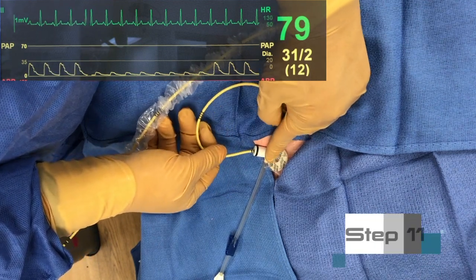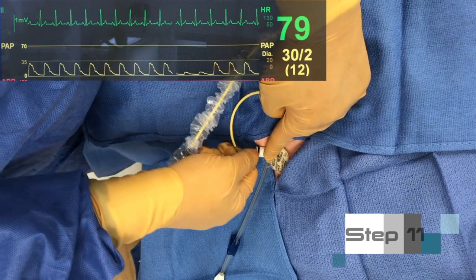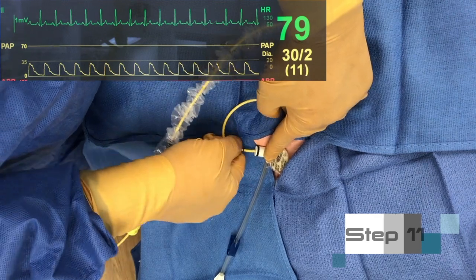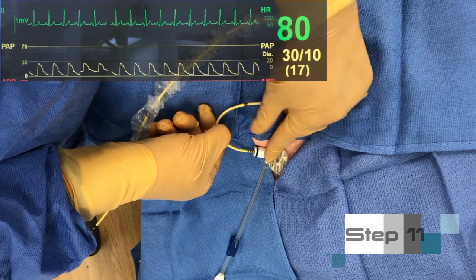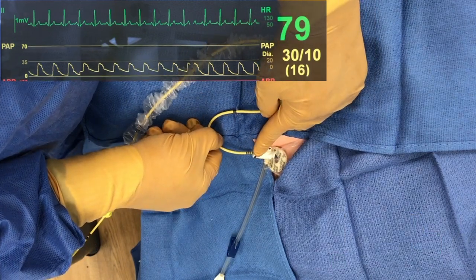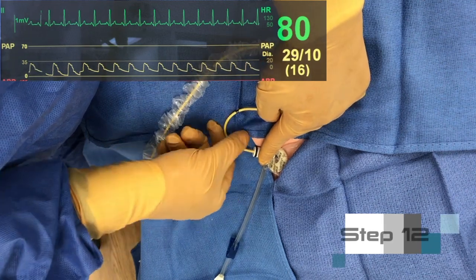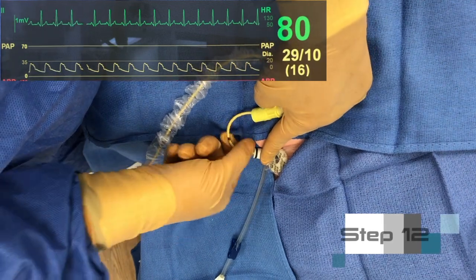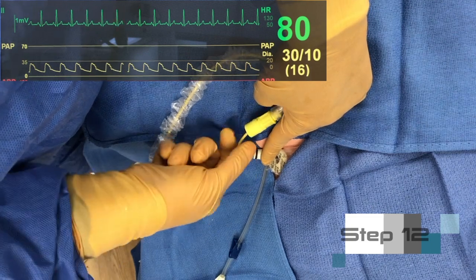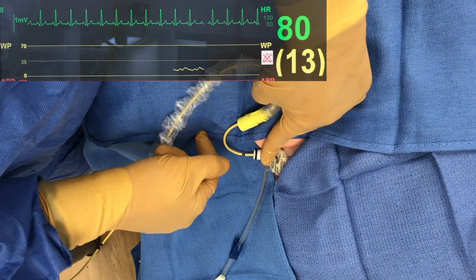Step 11. Continue advancing the catheter. At approximately 40 centimeters, the catheter tip should enter the pulmonary artery. This is confirmed by an increase in diastolic pressure and the presence of a dicrotic notch. Step 12. Continue advancing the catheter until a pulmonary capillary wedge pressure is observed. This is confirmed by a sudden drop in the mean pressure and a change in the waveform pattern.